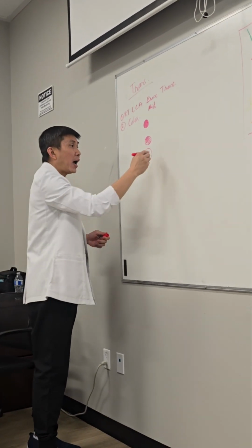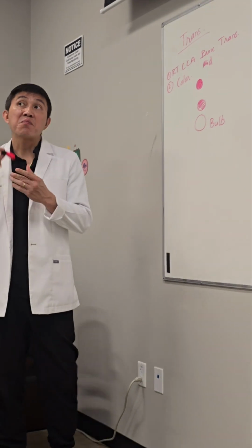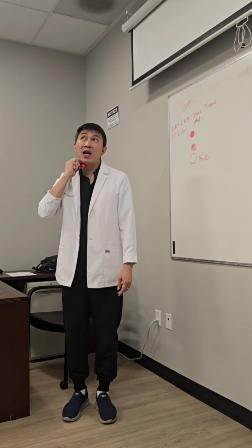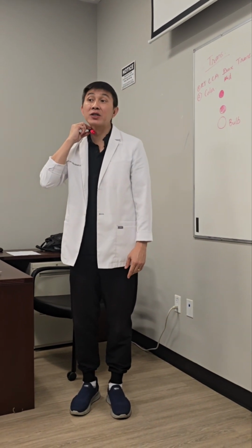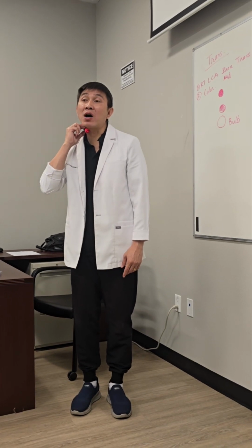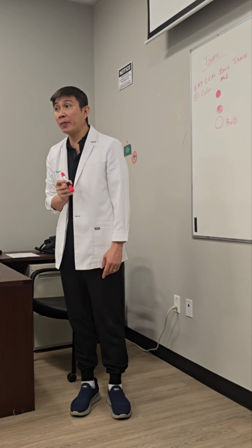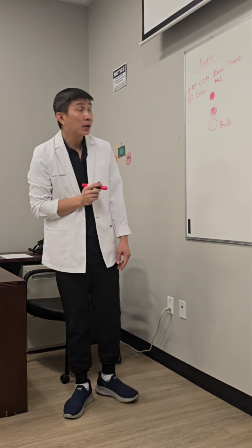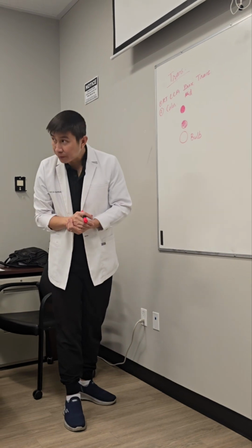And then the bulb is going to get larger. So you get the proximal, mid, slide up. Oh, bigger. Pause. This is the bulb. Go back. This is distal. All right, take distal. And then go backward. Bulb. Take the bulb, B mode and color mode. But the bulb is going to look different. Why? It's larger and the color is different.